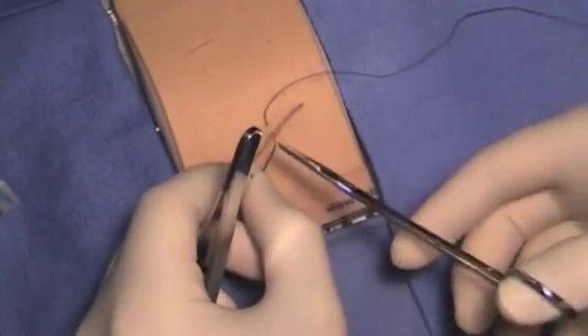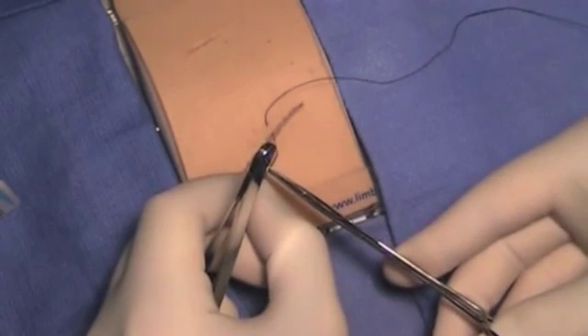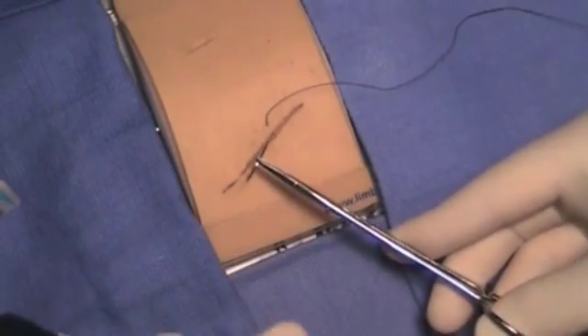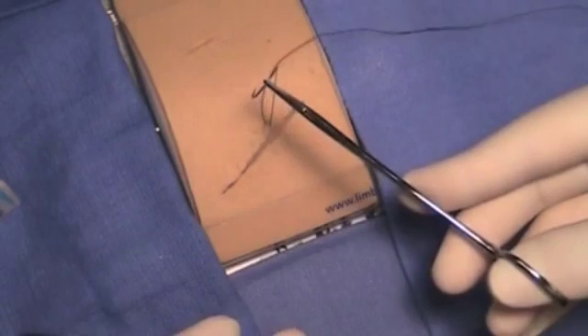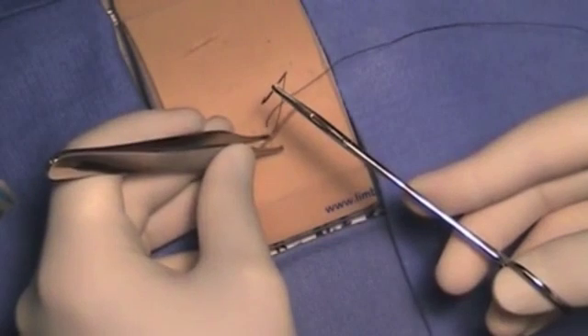If necessary, reload the needle properly: one millimeter away from the tip, perpendicular, two-thirds of the way down the needle. Pull the suture out just four to five inches, then re-grasp for a second bite.